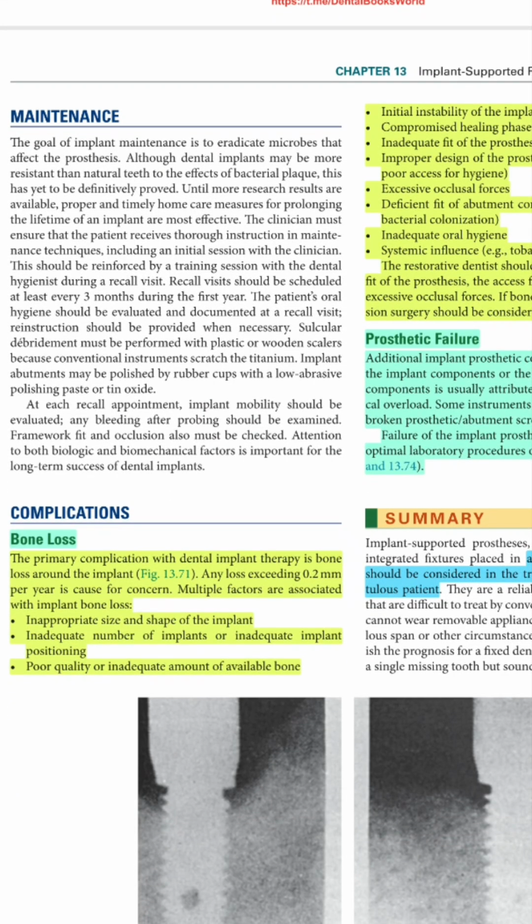As for the complications that may be encountered, there is bone loss.